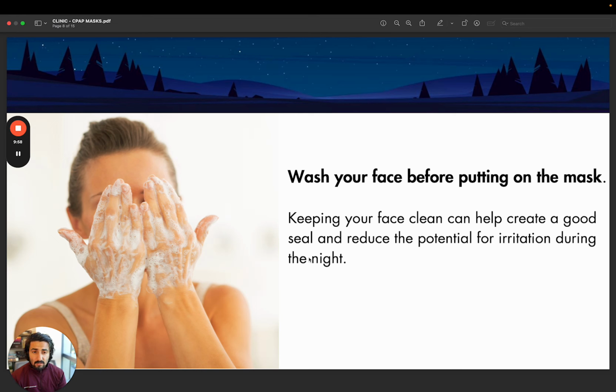especially if it's clogged. I've had patients develop skin reactions, dermatitis, and infections that can sometimes happen if the skin is not clean and that point of contact gets covered for 6 to 8 hours. So please make sure you clean your face before starting to use CPAP. It's good for hygiene purposes, and it's also good for the health of your skin.